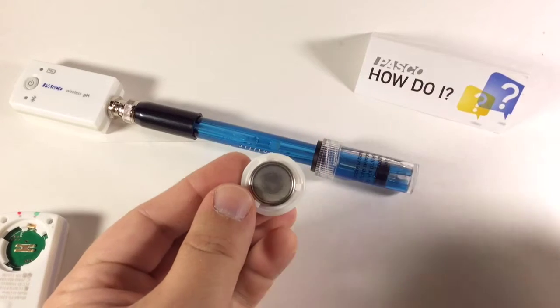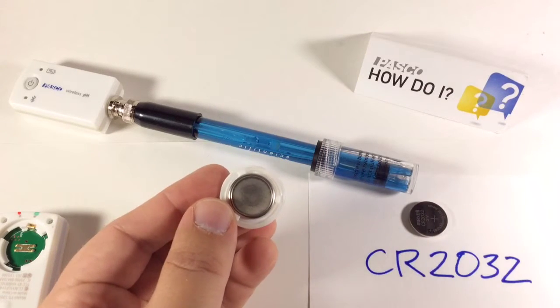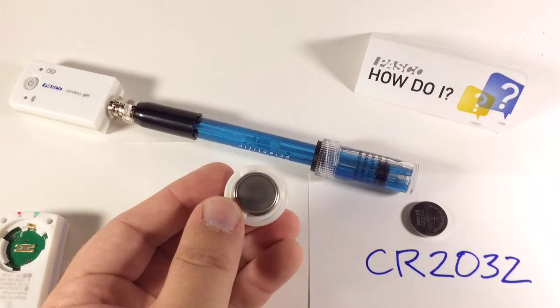So, there is the coin cell battery. This is a fairly common coin cell battery. CR2032 is the model. You can get this from Pasco and from many retailers around the world.